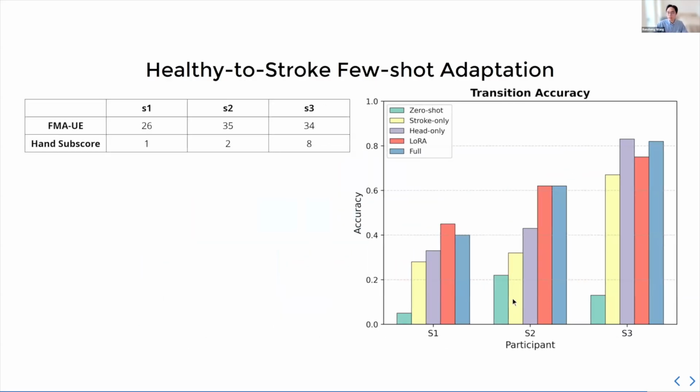And if I may interpret this a little bit, the performance gain actually corresponds to how impaired you are as a stroke subject. With S3, on the very right, S3 is our most functioning subject, and no wonder you get the highest accuracy.